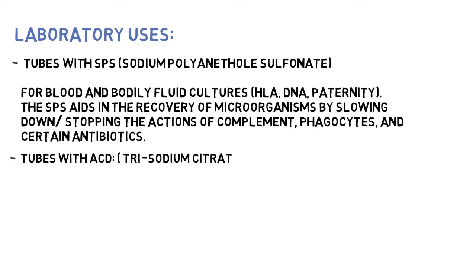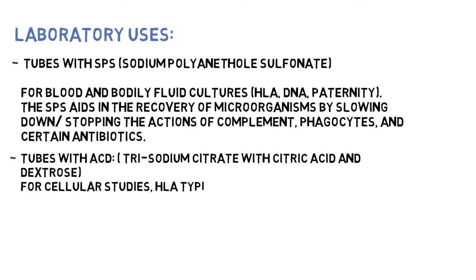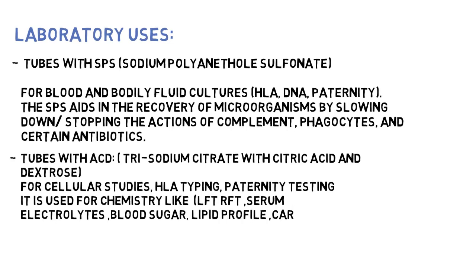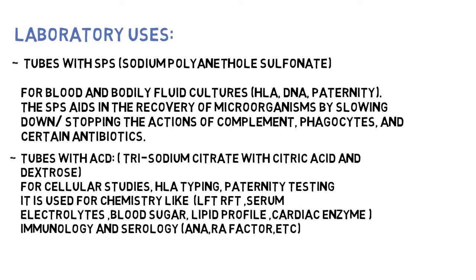Tubes with ACD are used for cellular studies, HLA typing, paternity testing. But it can be used for chemistry like LFT, RFT, serum electrolytes, blood sugar, lipid profile, cardiac enzymes, immunology, and serology, ANA, RF factor, etc.